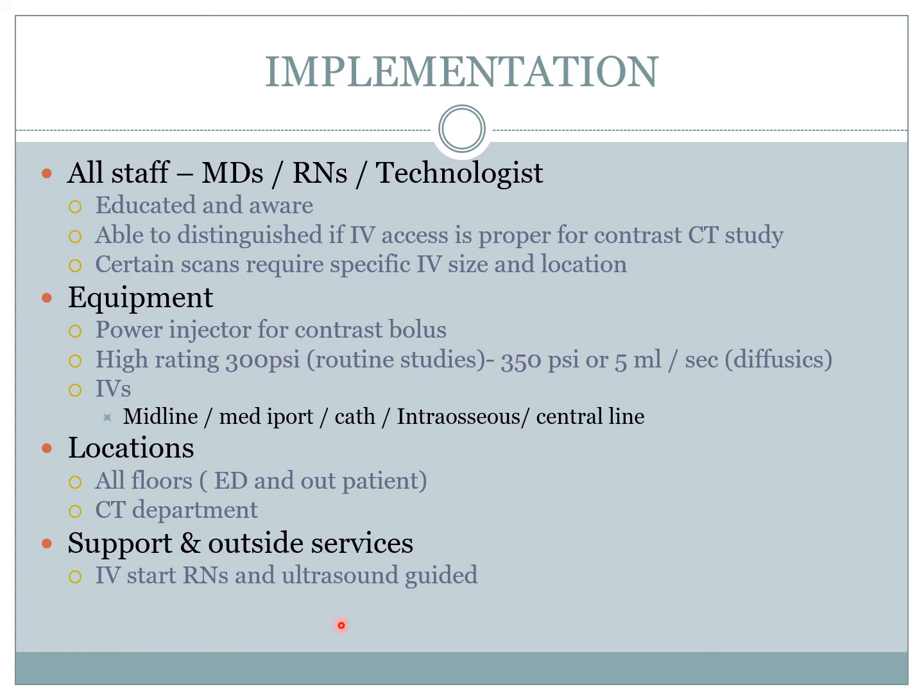They go in deeper and it's more visualized, but I've had ultrasound guided IVs not work before, multiple times, because of just location and the pressure that we use. So it's important.